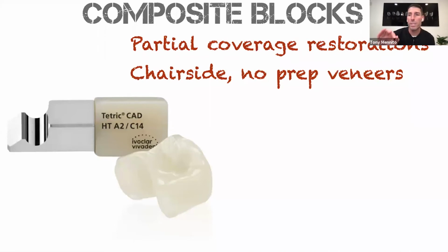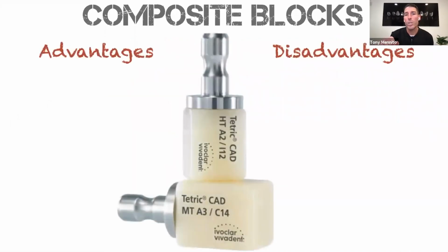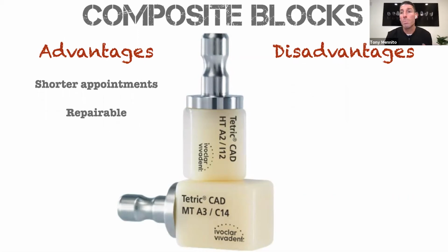Once again, the benefit of these is that you have shorter appointment times, because you wouldn't put this in the oven. If you put this in your oven, it's going to melt. So don't do that. Okay, shorter appointment times. We have the ability to repair them. So if we have an onlay and we get a decay at a little part of one margin, we can just repair that margin instead of removing the entire restoration, like maybe we would have to if that were a ceramic material. And like I said, we can mill these very, very thin, which is nice.